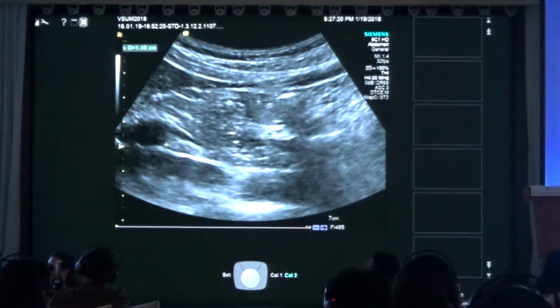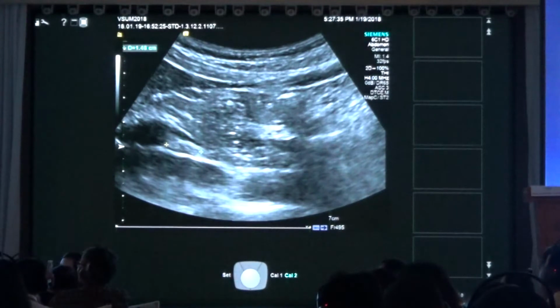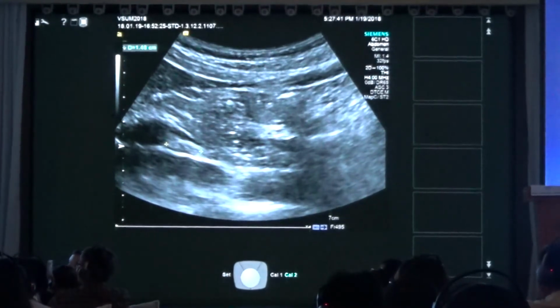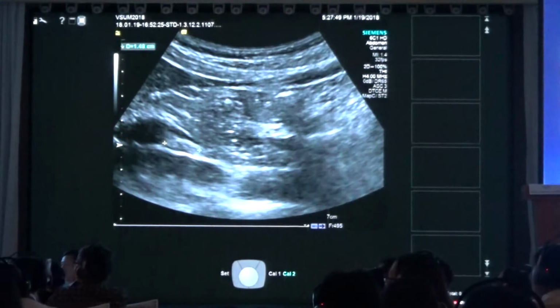I wonder if you have additional comments, Richard. So one thing, I always watch the B mode image when you're asking them to hold their breath, because they may take a breath or change, and you can see that the liver is moving when you do your measurement. If you have a patient that has a hard time holding their breath, you can watch the liver as they're breathing going up and down and try to do your measurements always in the middle position.